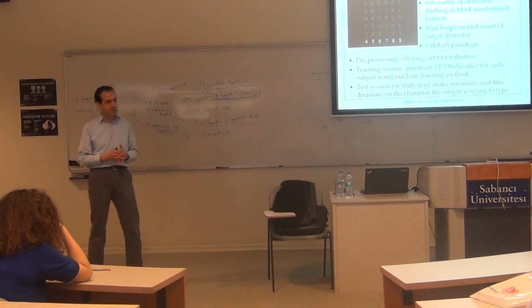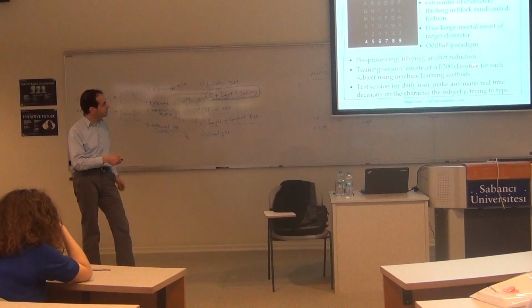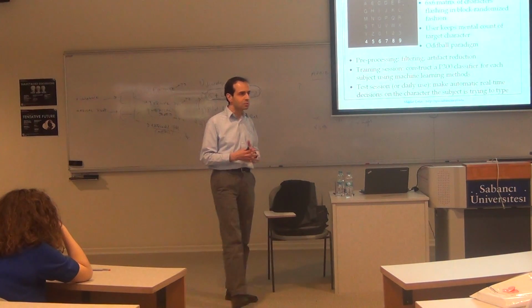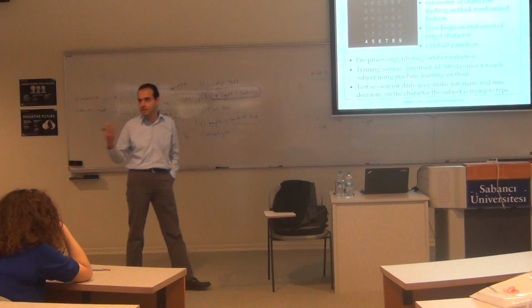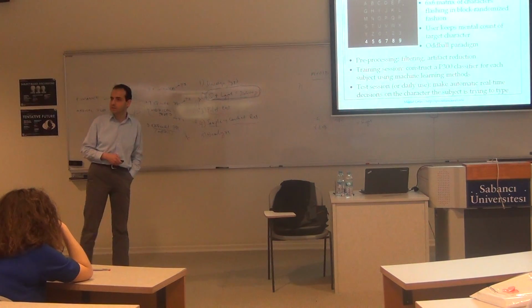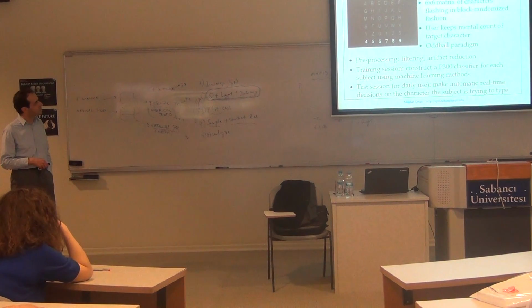The subject just does what he or she usually does. In this training session, you essentially learn the parameters of a classifier. That's the decision rule that your algorithm will use to make decisions. Once you do this training, then the rest is a test session or daily use. Whatever you have learned here, you use that logic to make decisions in real time. So that's the way algorithm development works.